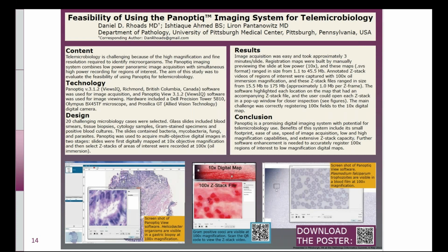Another clinical pathology use case for the Panoptiq system included telemicrobiology. Telemicrobiology is traditionally very challenging due to the high resolution required to identify the very small microorganisms, and is difficult even with whole slide scanners. 20 challenging microbiology cases were selected in this study and scanned at 10x magnification and under 100x oil immersion. The authors had similar conclusions to the other studies, where they stated the Panoptiq system's benefits included having a small footprint, ease of use, generating small file sizes, the regional Z-stack capabilities, and having system flexibility.